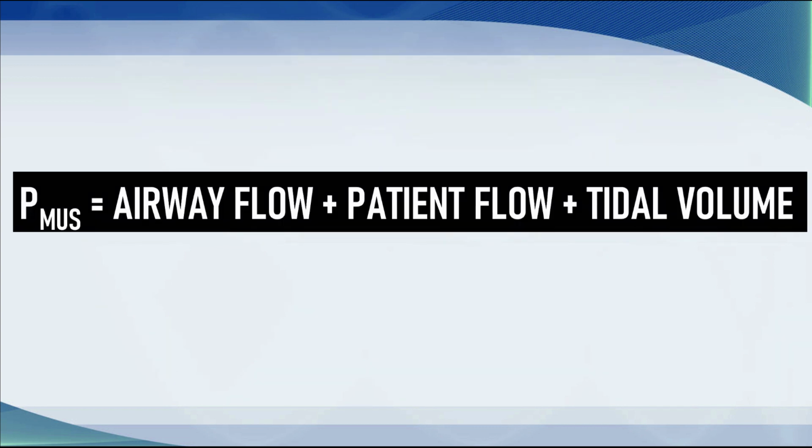Remember, PAV Plus is a spontaneous breathing mode of ventilation. If the patient isn't breathing, you can't use it. The ventilator absolutely must know whether the airway is a tracheostomy or an endotracheal tube, and it needs to know the internal diameter so it can calculate flow resistance through the tube. From this equation, the ventilator can calculate how much pressure support to deliver to the patient to harmoniously amplify the spontaneous breath. The ventilator can only amplify the flow generated by the thoracic pump. The patient must initiate the breath.